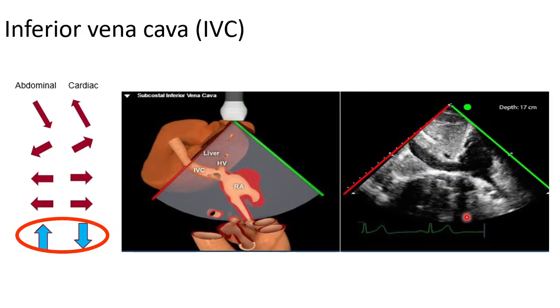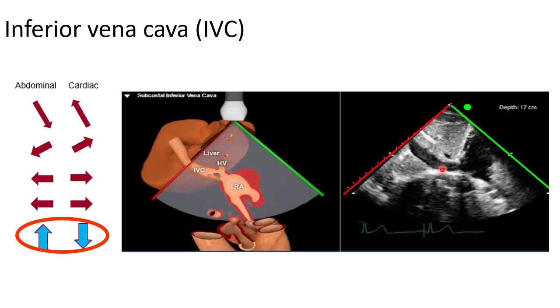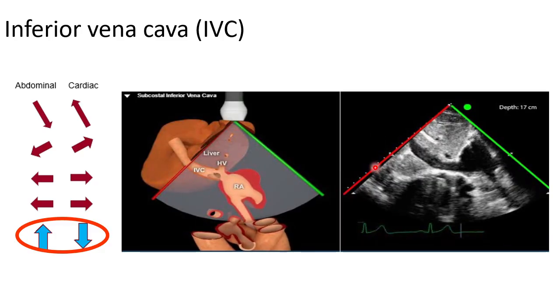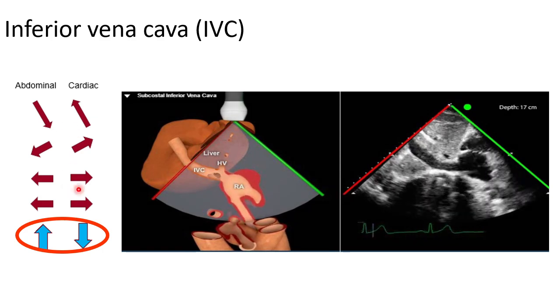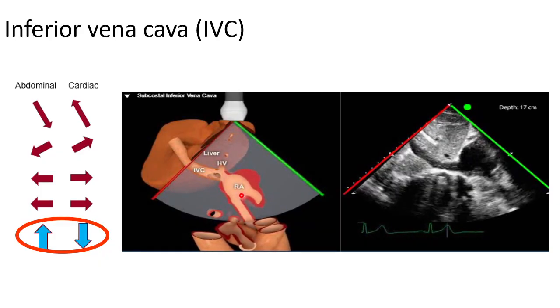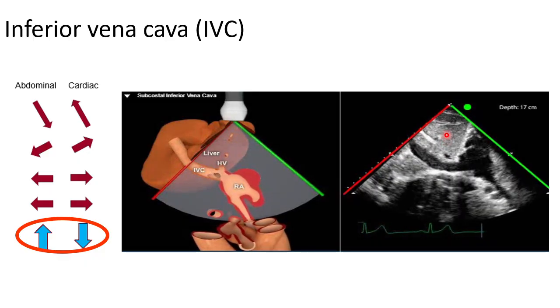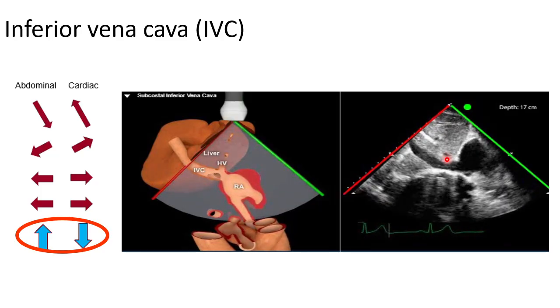Now you will see this more commonly than the cardiac views be 180 degrees, so the heart is on the left side. Less important when you're looking at the IVC, but when you're looking at the heart, the standard is the standard and you need to do it the correct way. So here's the RA. Remember, the IVC flows into the RA. This is the liver here. This is your hepatic vein.